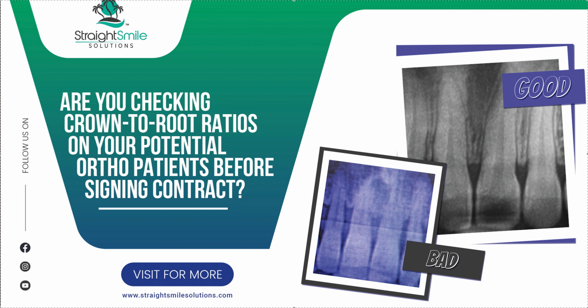Today we're going to talk about crown to root ratios on your ortho patients. As you know, I always recommend ideally having a panoramic x-ray. You can do a recent FMX as well, but a pano is always better because we can check for more pathology. You're going to have some blind spots in the FMX, and I've missed things before, like supernumerary teeth or odontomas, so pano is always the gold standard.